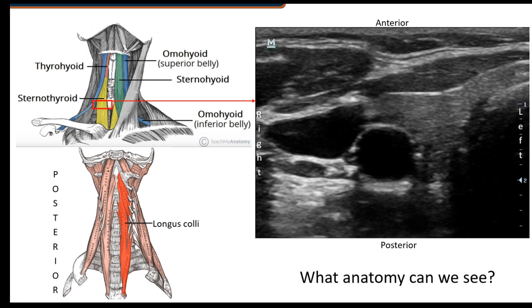The last thing to point out is the longus colli — our depth landmark. We set our depth there. We don't see it well because the sound beam attenuates quite a bit in this area. Remember, this is a linear probe, so all that energy gets used up pretty fast going deeper into the body. We set our focal zone at our area of interest, which is the most posterior aspect of the thyroid.